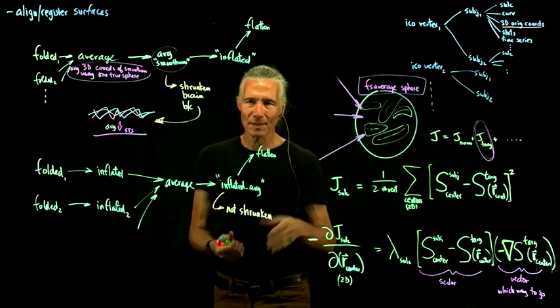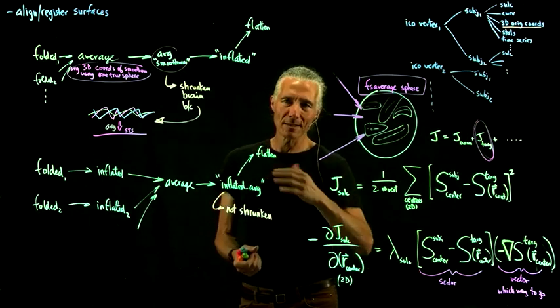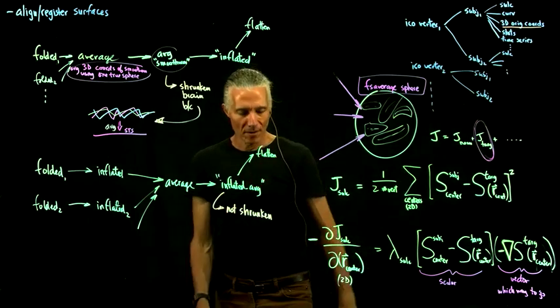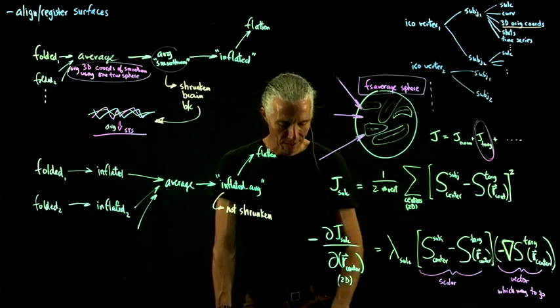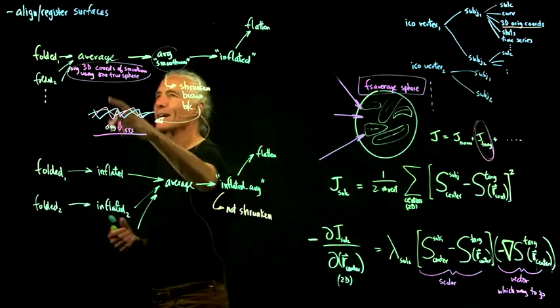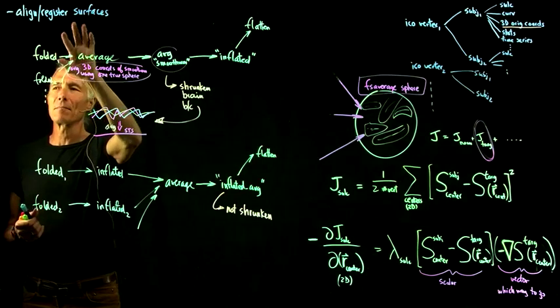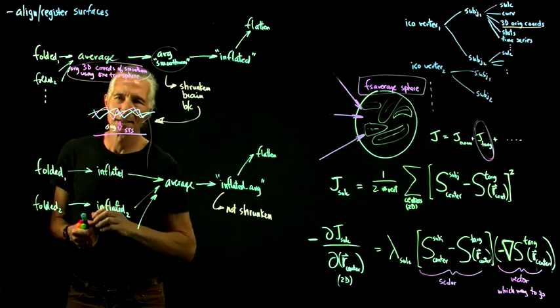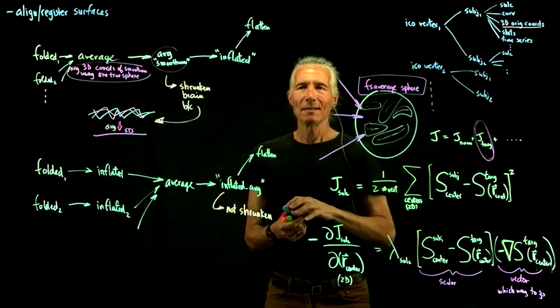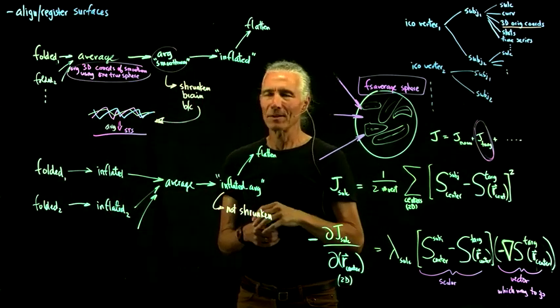There are other surfaces down in the brainstem, like the superior colliculus, which is a surface and has a map on it. And there are auditory maps down there that are shaped like surfaces. So that's how to align and register surfaces in order to get better cross-subject alignment of data, so that we can do better averaging of data.